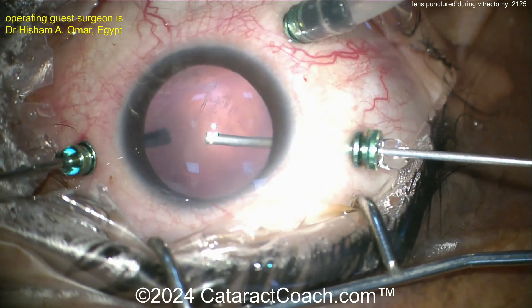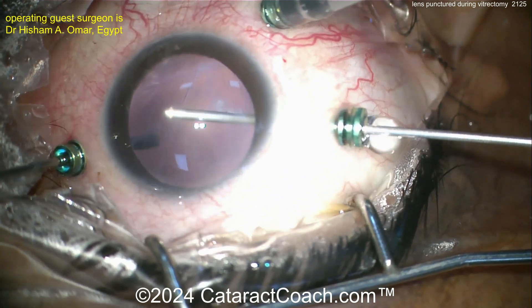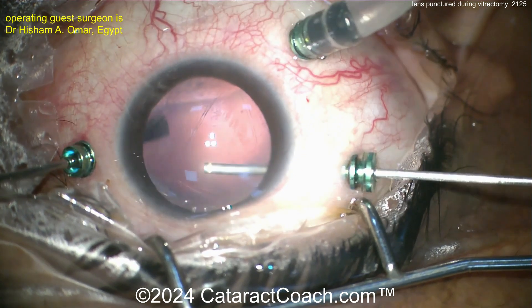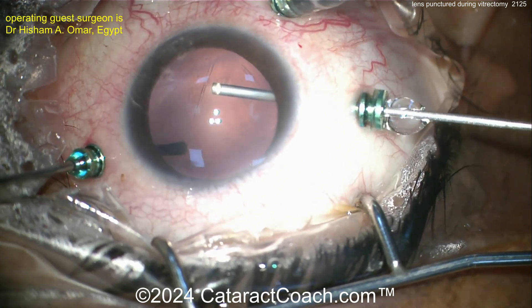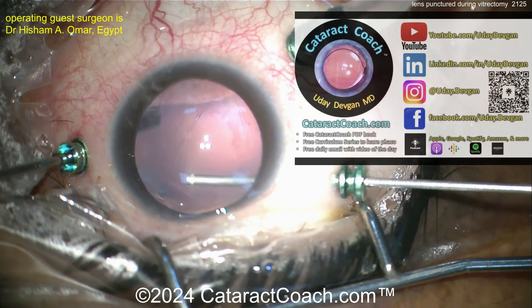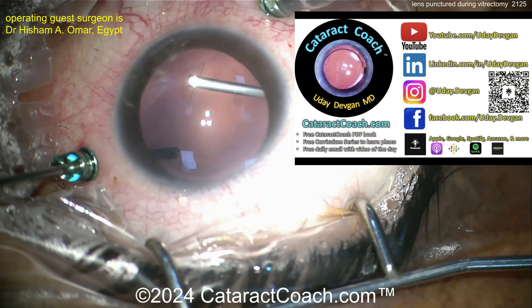Optic captured through an anterior capsulotomy — there we go. Using the vitrector now to create an anterior capsulotomy. You don't need to do a rhexis; just use the vitrector. Make sure you get it to an appropriate size — about five millimeters — and make sure there are no edges that want to run out on you. That looks pretty good.